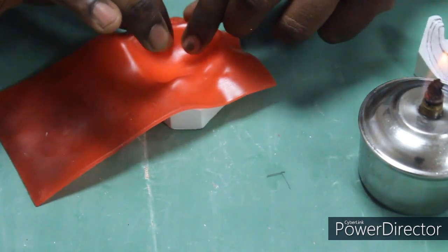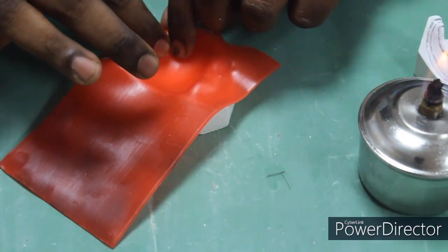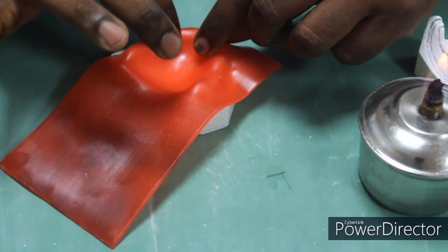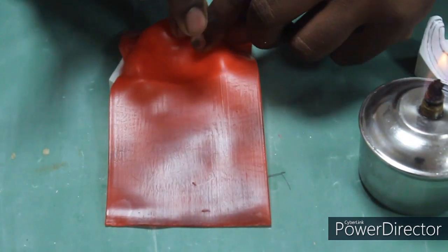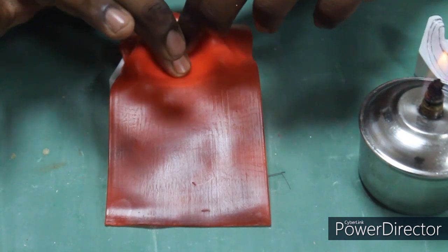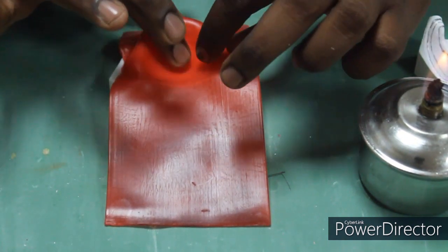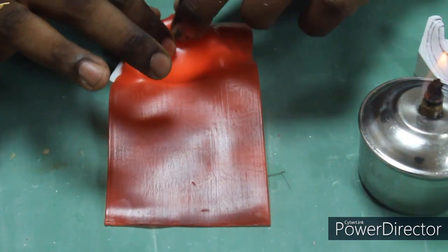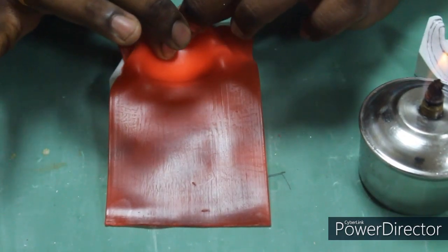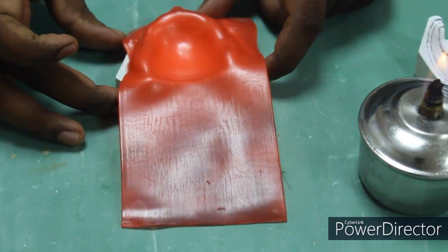By adapting onto the cast, you can visualize the black line which was drawn on the cast. Using that as a reference, you can cut the excess wax. You can limit the wax extension up to the desired spacer outline which was drawn on the cast. Similarly, you have to do it for the mandible also.